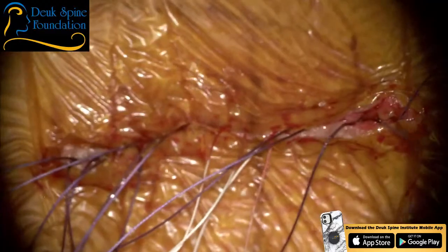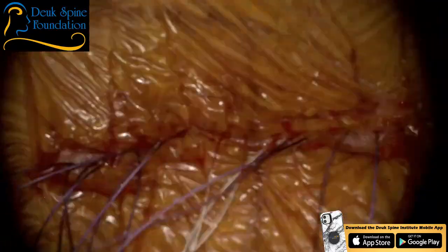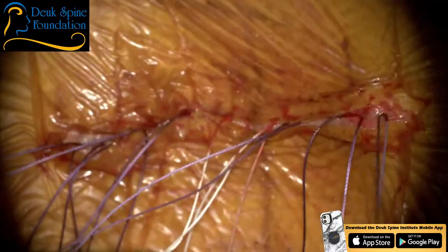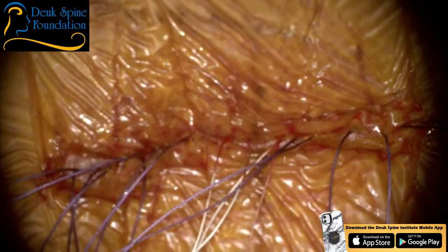Any other questions, Sean? None currently. I think we're done, Luis. I may need one more. You always want to get that one at the bottom, because that keeps all the juices from coming out and really scaring the hell out of the patient. Okay. I think we're done.